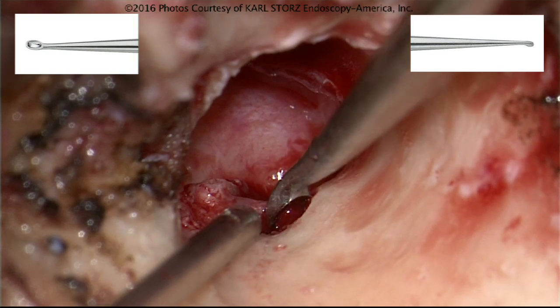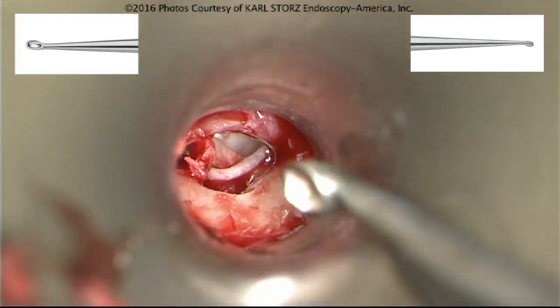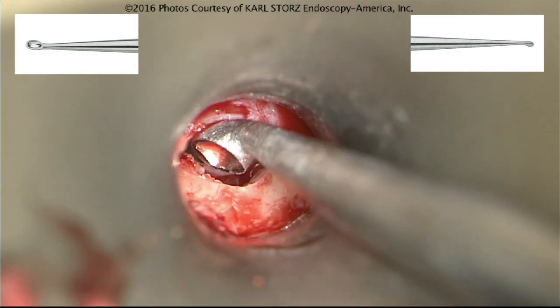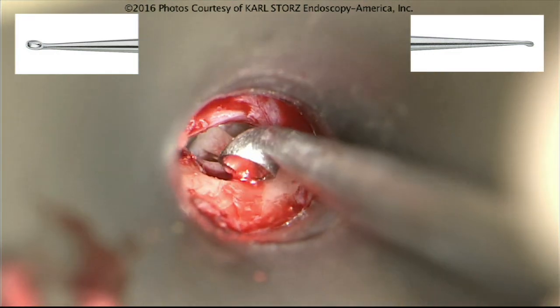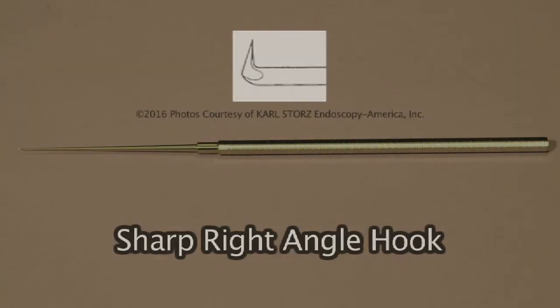It's also important to make sure your curettes have been sharpened. Sometimes curettes get very dull, especially in residency programs where they've been around for a long time. That's when it's helpful to get either new curettes or have them serviced.